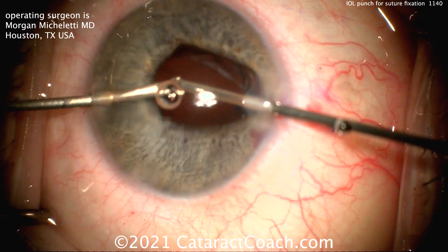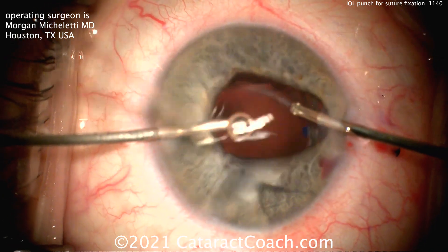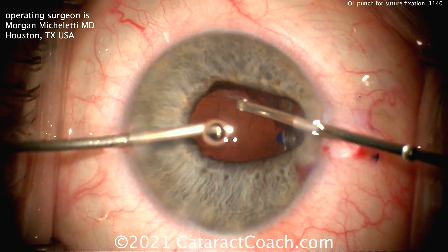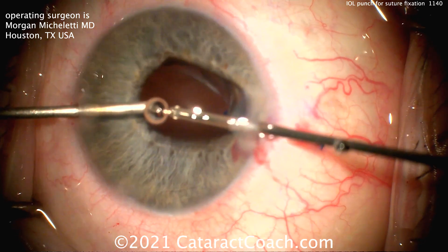An anterior vitrectomy is also done to clean up any prolapsed vitreous — that is an important part of this procedure. You don't want to entrap any vitreous in all the maneuvers you're doing here.